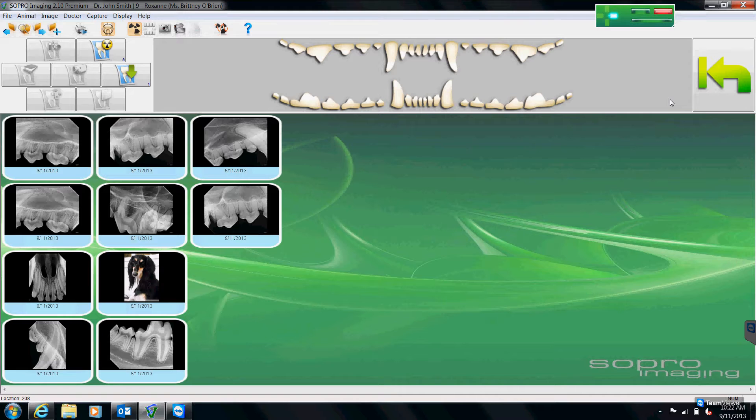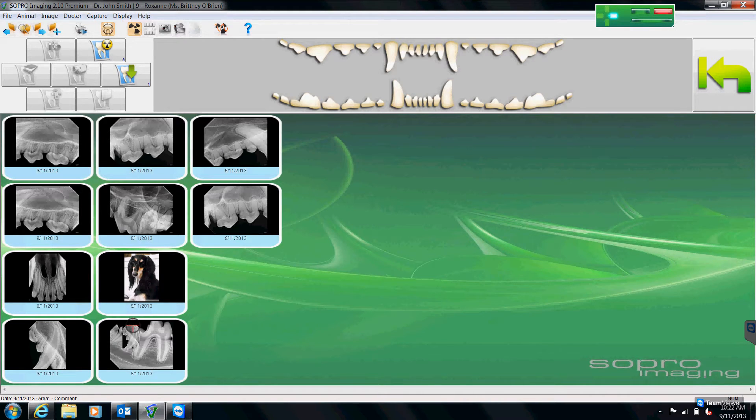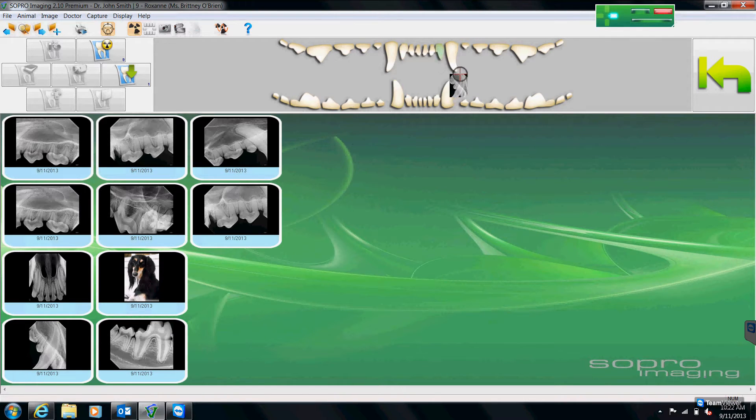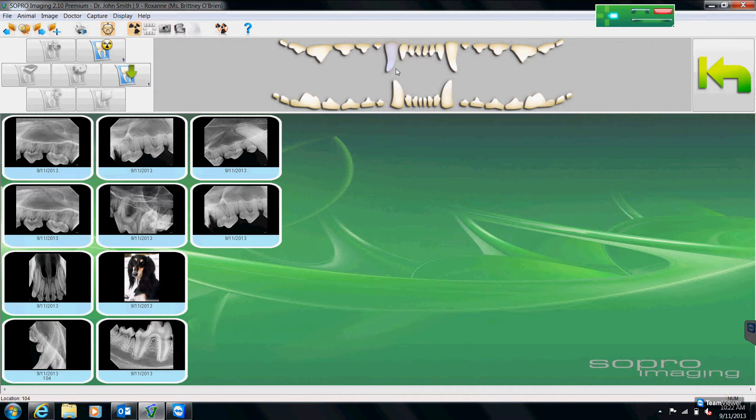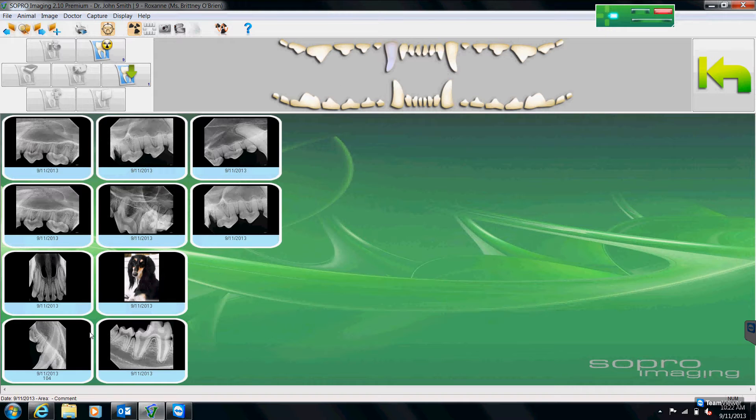The first is that after we shoot all our x-rays, I can literally drag and draw the image onto the correct tooth. And when I do that, you'll see the tooth then turns this bluish gray color and then underneath the image is numbered for us.